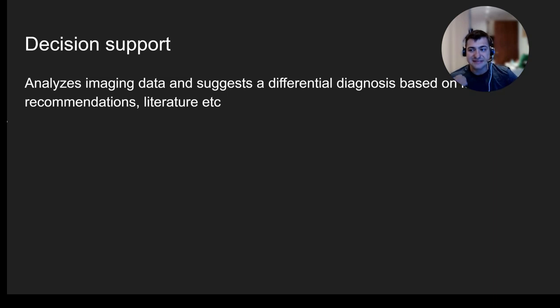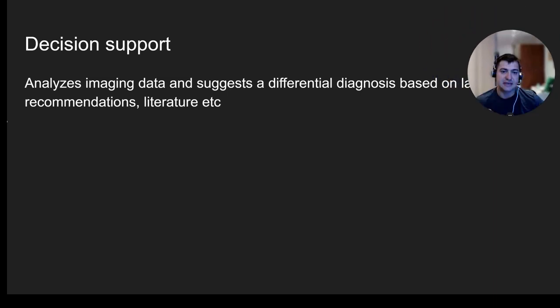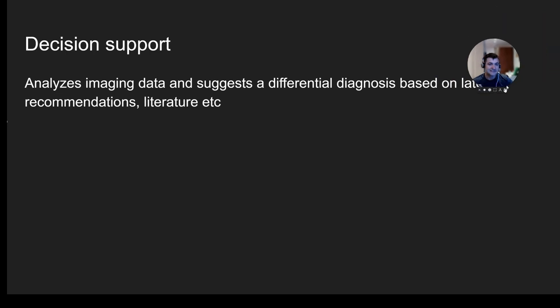Decision support. Now, decision support is, again, a fairly simple concept to grasp. A physician analyzes various aspects of data associated with the patient, so whether this is imaging, whether this is charting, whether this is some kind of information they get from other sources, they need to keep in their mind a very large amount of data. And it's easy to overlook something. It's easy to forget something.